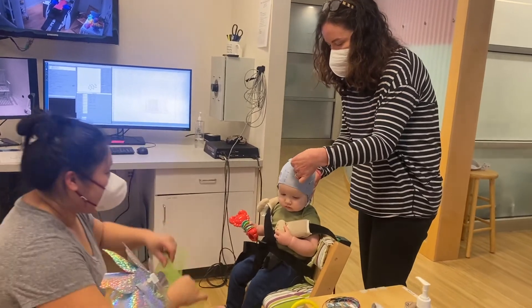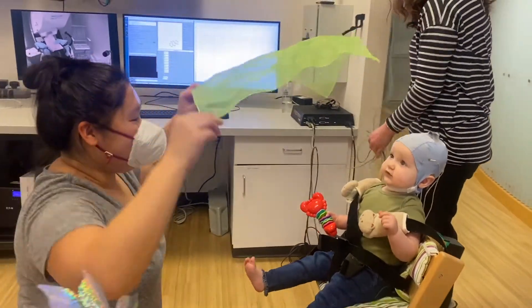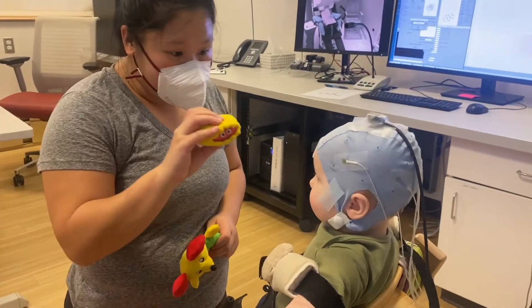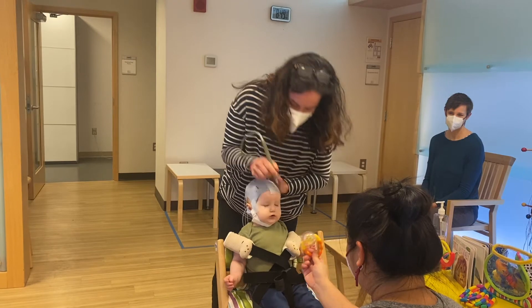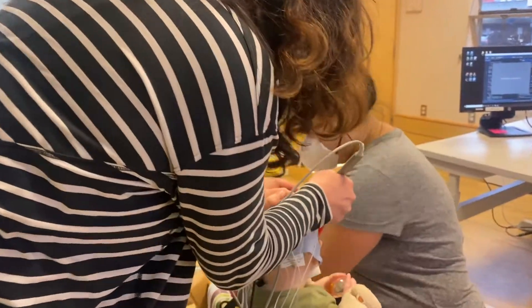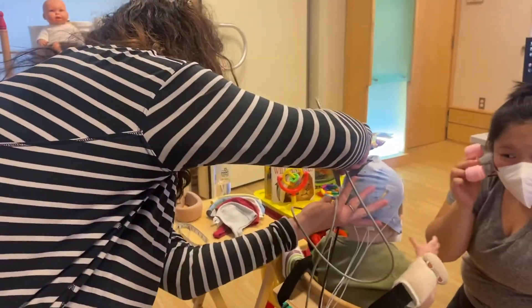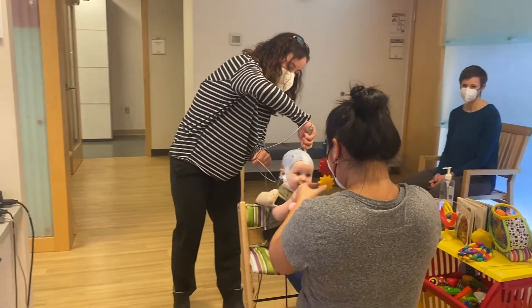The digitization process is especially important for infants. Good representation of the head shape, as well as accurate digitization of cardinal points and the HPI coils, are essential for accurate source modeling. Here the technician is digitizing the cardinal points using the Polhemus device. Note that the cap allows for the ears to be exposed so the technician can properly access the cardinal points. The technician also digitizes the location of each HPI coil and additional points along the surface of the infant's head. We want to capture as many additional points as possible while the infant is still happy and compliant. We suggest getting a minimum of about 200 points.